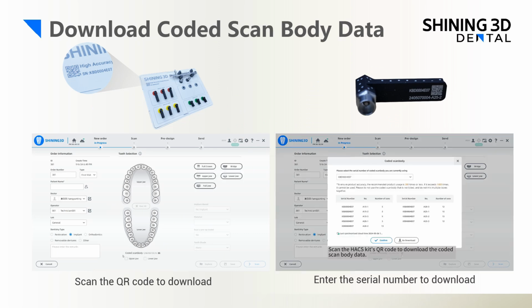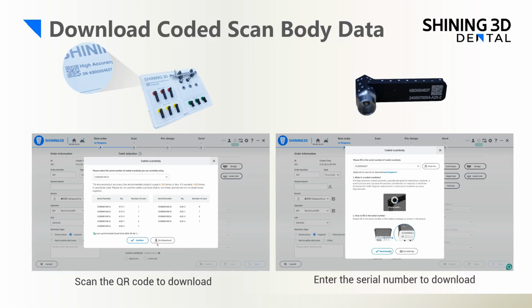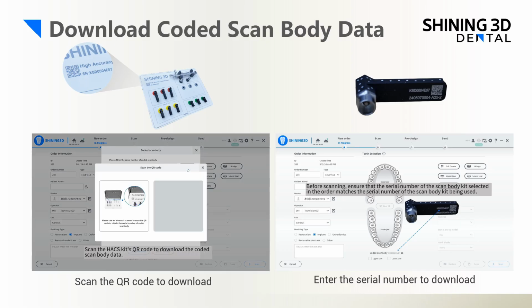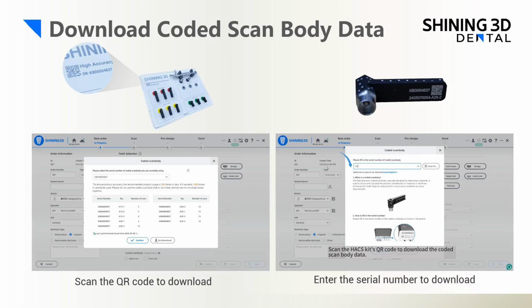For the first time use, you need to scan or type in the serial number to download the coded scan body data of the kit you're using. Before each scan, make sure to verify that the data selected in the software matches the serial number on both the kit you're using and the scan bodies.